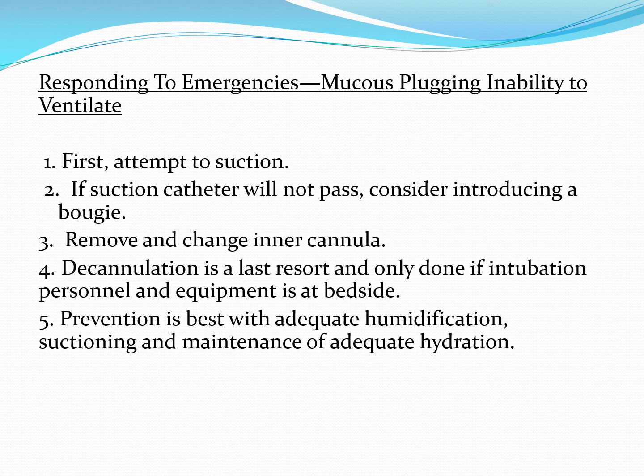But there should always be an extra inner cannula in this patient's room, because you cannot ventilate with most Shiley tracheostomy tubes. You cannot ventilate the patient if they're on mechanical ventilation. You can't attach that tubing unless there's an inner cannula in place. There are others. There's Portex tubes where the inner cannula doesn't actually have a flange on it. The flange is part of the tube itself. But Portex tubes are not commonly used. So in all cases, you really should consider strongly ensuring that there's extra inner cannulas at the bedside.